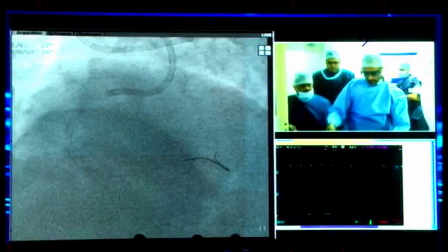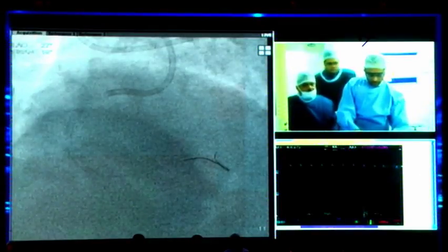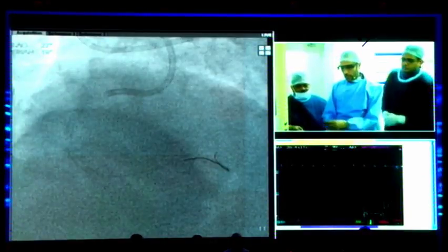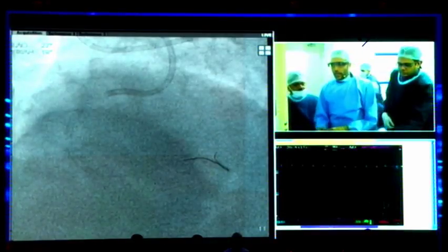It's not bleeding from here, right? Guys, is it bleeding from here? Okay, so now it's closed, right? Okay, good. Just making sure. Okay. It's all good.